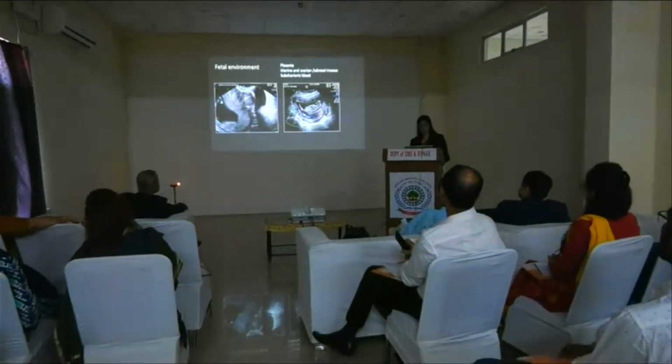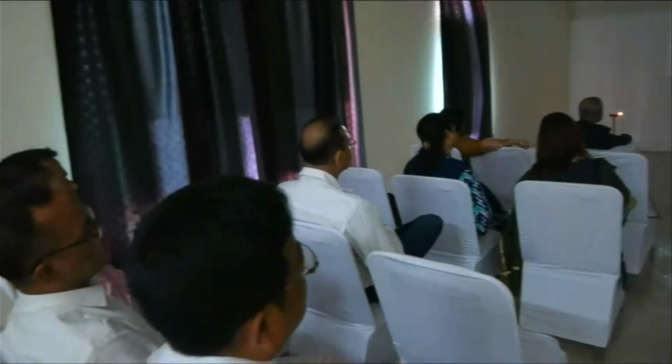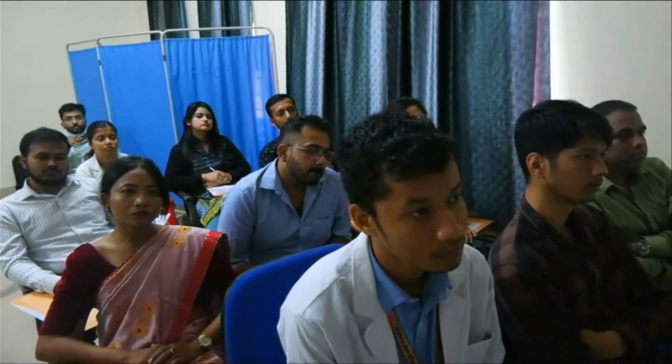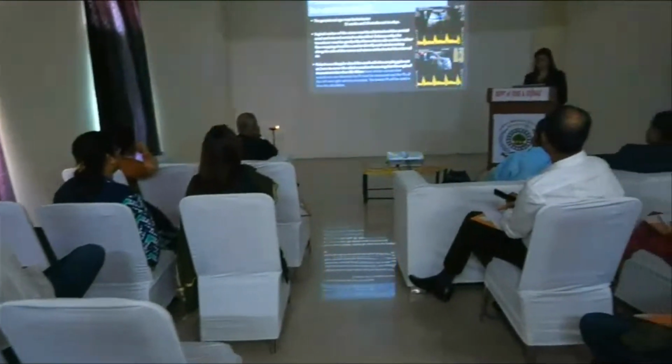After this, we need to look at the fetal environment also, because sometimes we can document fibroids. We look at the placenta, we see if there are any subchorionic bleeds or whether there are any myomas, and we have to document them because low-lying myomas can sometimes cause obstruction in labor, and a large amount of subchorionic bleed might have a bad prognosis. Document the cervix, both trans-abdominal and trans-vaginal if possible.